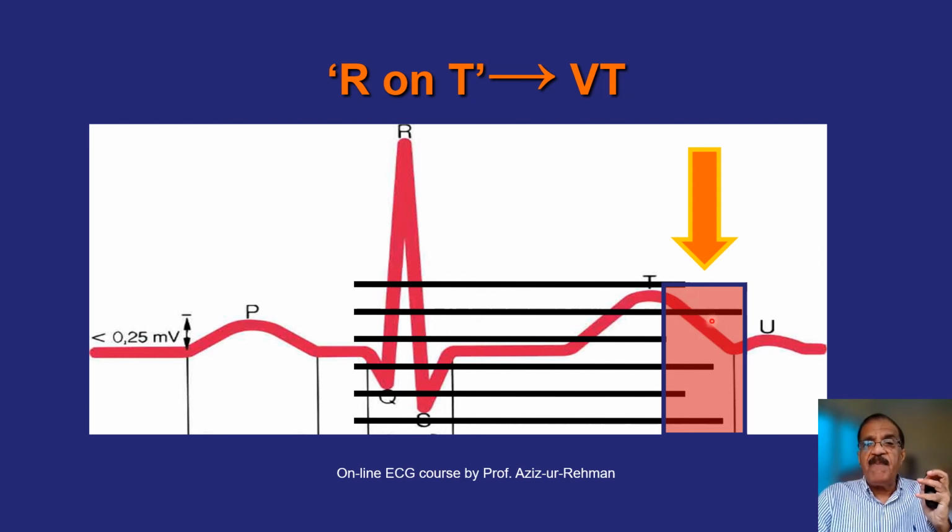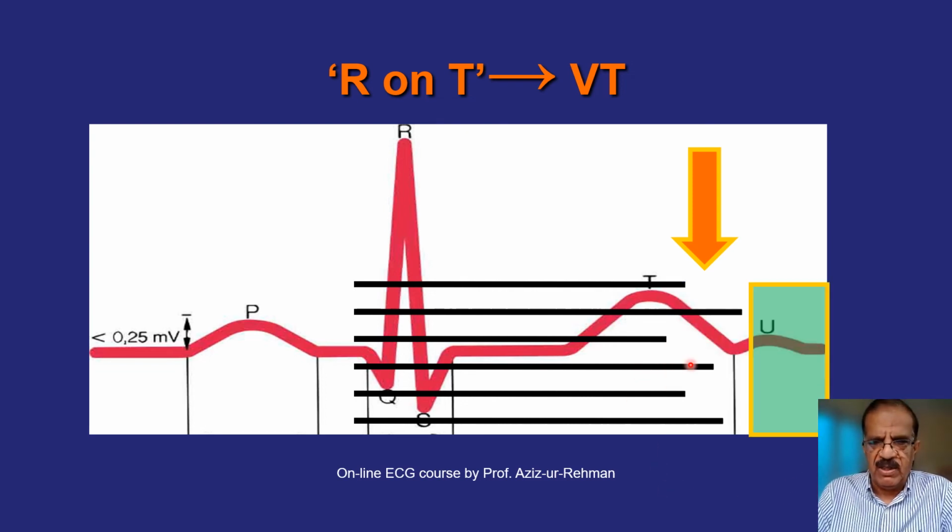And by the time this muscle responds in the form of depolarization, this one will be ready to receive the current, and then other muscle may be ready, and this is how one after the other multiple muscle cells depolarize and a ventricular tachycardia is sudden, and this is then followed by another refractoriness. I hope I was able to explain. Read more on this. This is interesting.